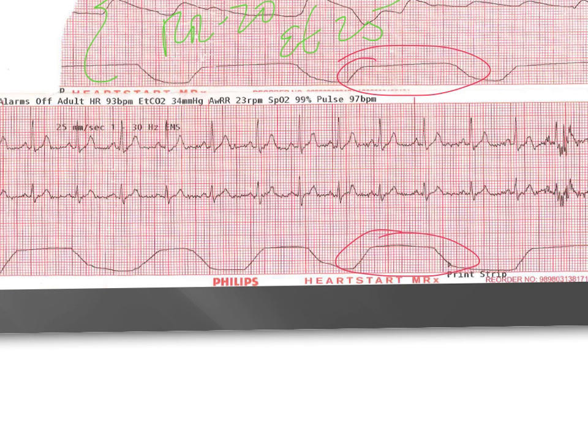However, this waveform is relatively crisp and clean. There are some variations where there's some rounding, but that looks like it might just be an aberration based on this patient. So in this instance, we may actually have a higher end tidal CO2, maybe closer to 30 to 35 based on the other ones. However, the respiratory rate is a little bit faster as well.